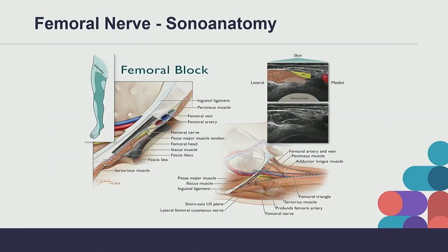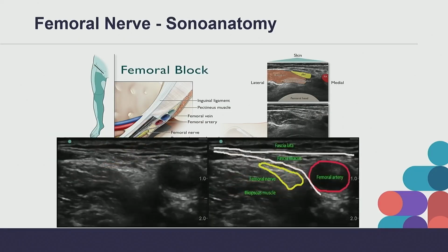In terms of the anatomy of the femoral nerve, it tends to lie just on the lateral side of the femoral artery, like we just discussed. The two pop technique, again, would be coming 1 centimeter over laterally to the femoral artery, popping through the fascia lata and then the fascia iliaca, and then you were probably somewhere around here when you saw that quadricep twitching. The other thing to note is that the femoral nerve looks kind of linguine-shaped instead of a spaghetti-shaped nerve. It tends to be sandwiched between the fascia iliaca and the iliopsoas muscles.